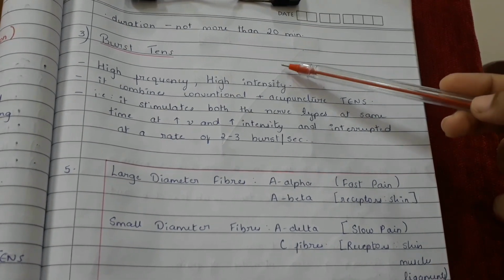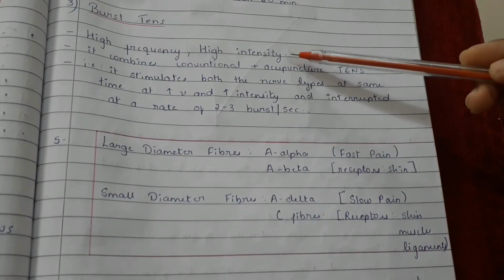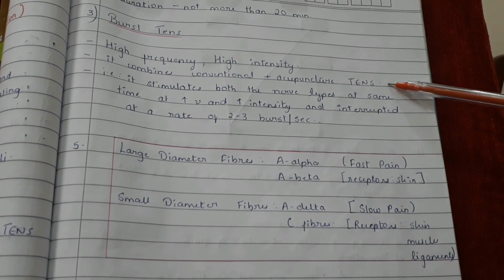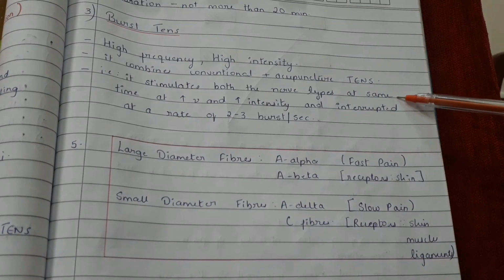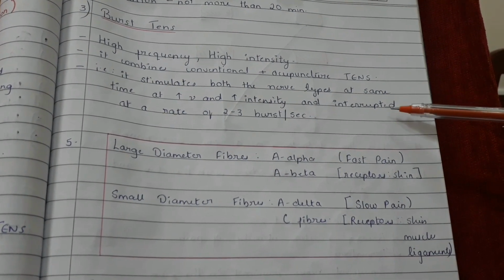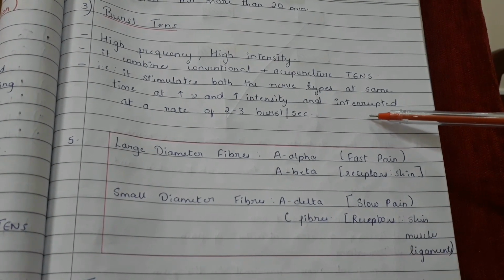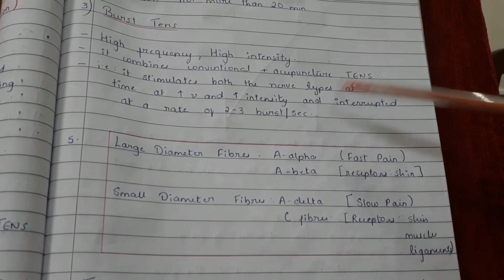Next we have the burst TENS. It is made up of high frequency and high intensity. It combines conventional along with the acupuncture TENS. That is, it stimulates both the nerve types at the same time at high frequency and at high intensity, interrupted at a rate of 2 to 3 bursts per second.